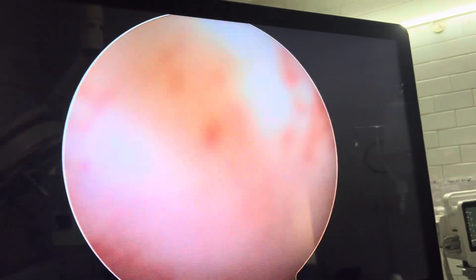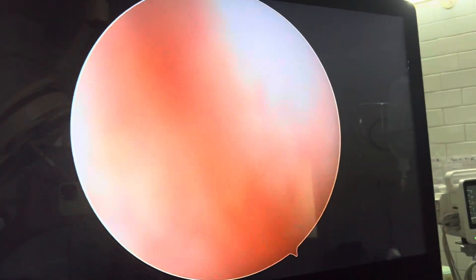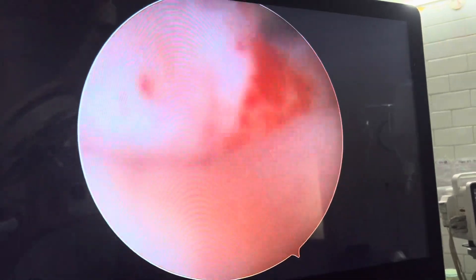Once we put the hysteroscope and start the flow of normal saline, the copper T keeps going in. We'll then have to grasp the stem of the copper T firmly and try to remove it.